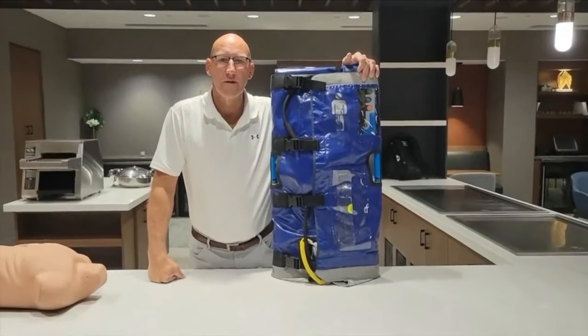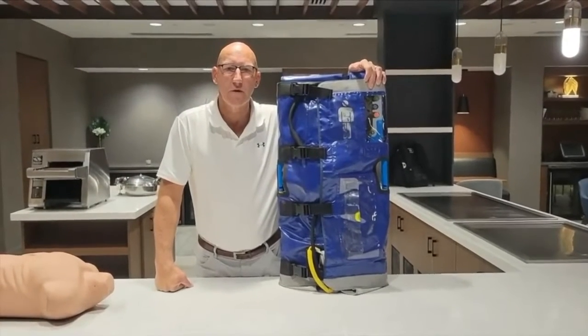Hello, my name is Rod Chan with ZOL Medical. I want to show you just a few highlights of the ZOL AutoPulse Mechanical CPR device.